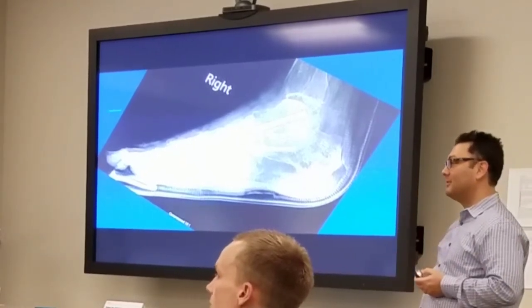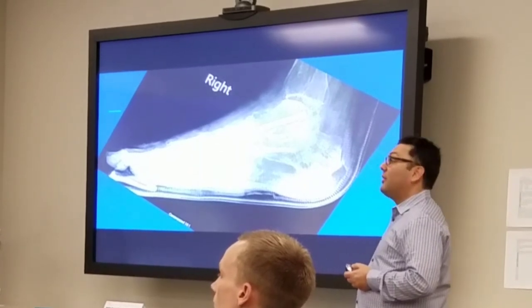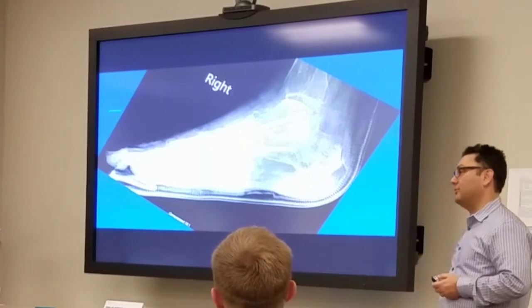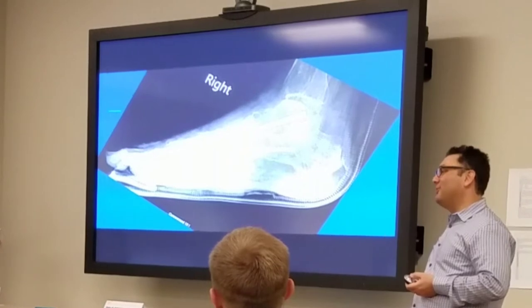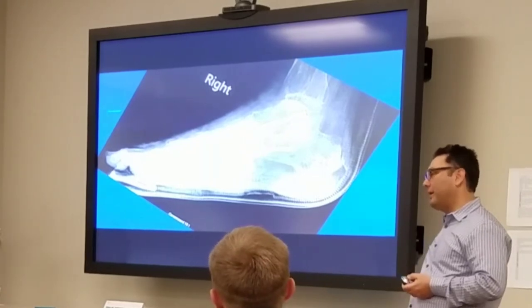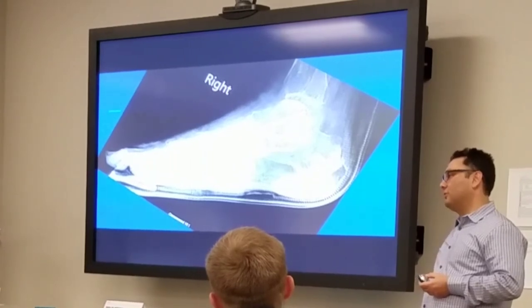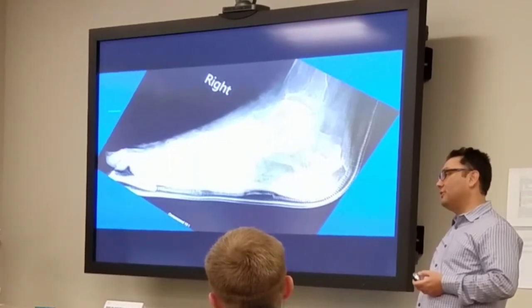Do you have a home health nurse just go in and adjust all these patients' struts? Some of the patients are excited to do it themselves, or their husbands are excited to do it for their wives, for various reasons. If they don't feel confident in doing it for whatever reason, I'll arrange with a home nursing program that the nurse will go in and do the turns. And it works out really well. Home nursing, they're happy to do it as long as they're trained.